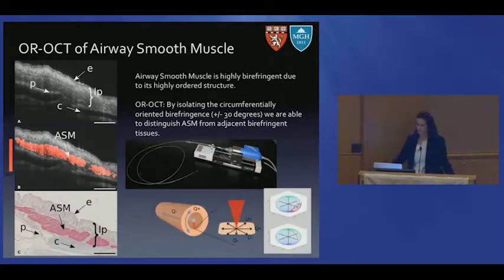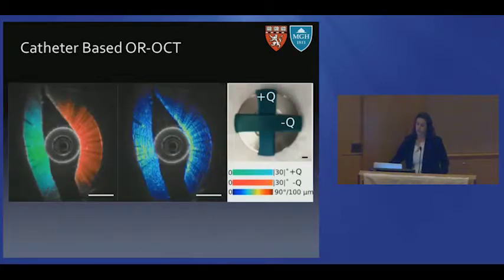And it was actually someone who is now a junior faculty in my lab, but at the time a postdoc in the lab, who realized that we could leverage the birefringence of the sheath that we're imaging through. Although it's almost transparent, the polymers align themselves in the direction of extrusion. So it does have some birefringence as well, and we could use that to calibrate the system so that we could essentially resolve the circumferentially oriented optical axis. And that was a real breakthrough.